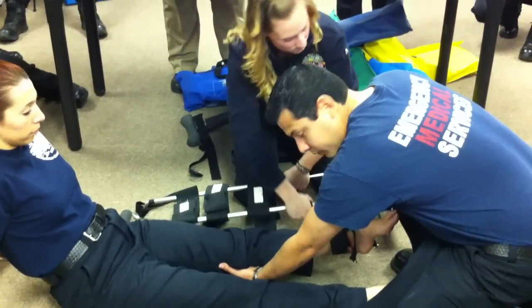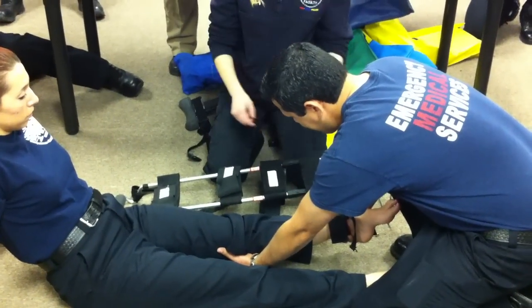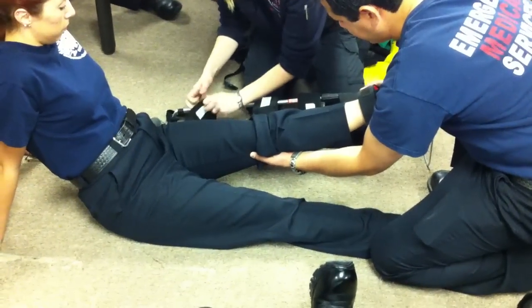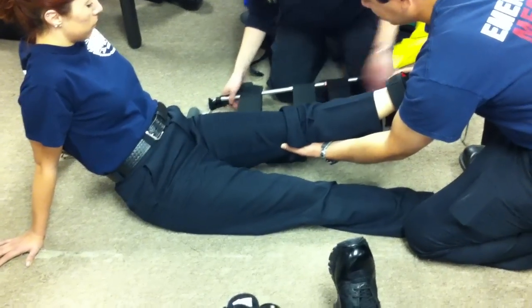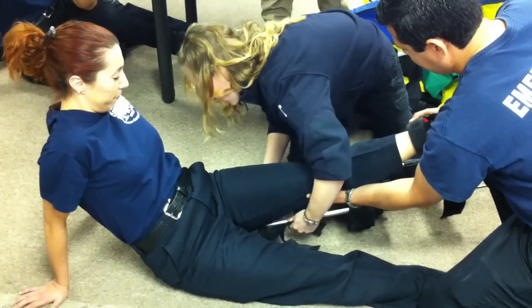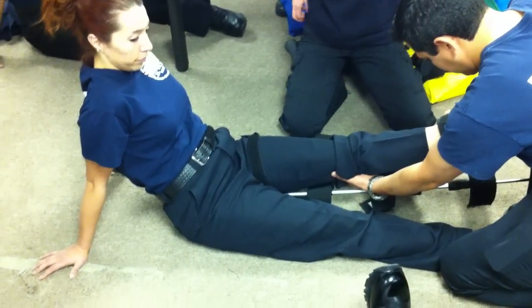Okay, what's it say next? Advises crew to maintain traction and support the leg while the device is placed under the injured leg. So I'm going to have Victor pull manual traction while lifting her leg up. Make sure you have your strap set up. If you notice, there are 4 straps on this device, and make sure your groin strap is free as well. Lift her leg up higher. It's going to sit right under your butt cheek area. It's not going to be very comfortable, and I apologize.